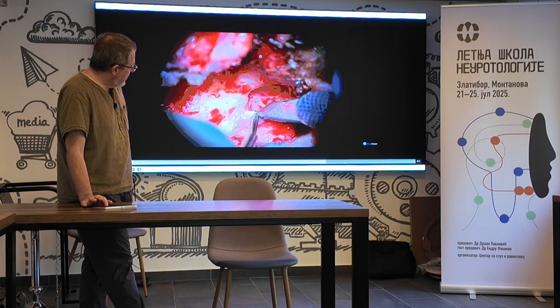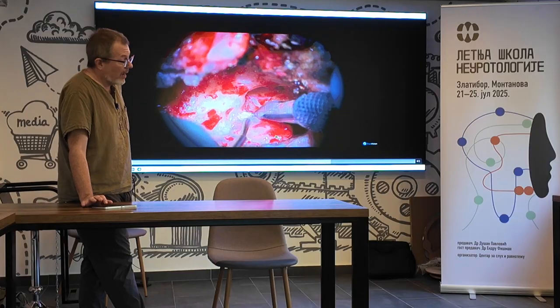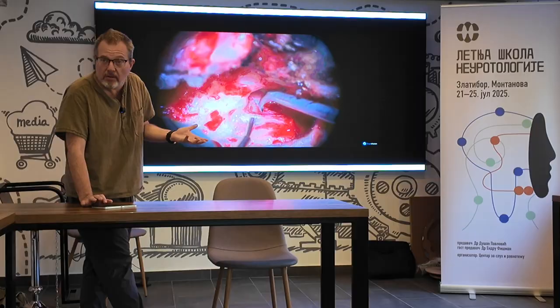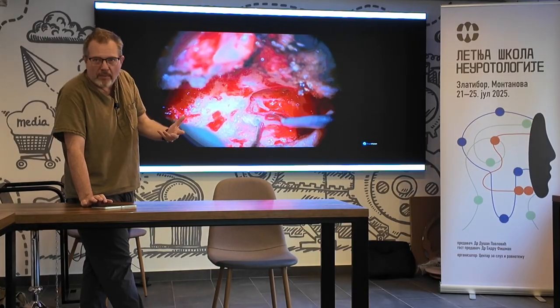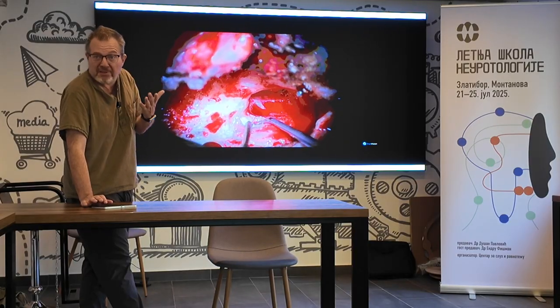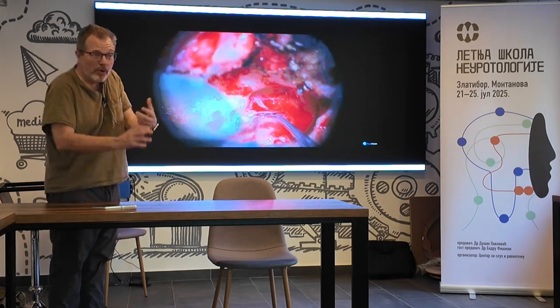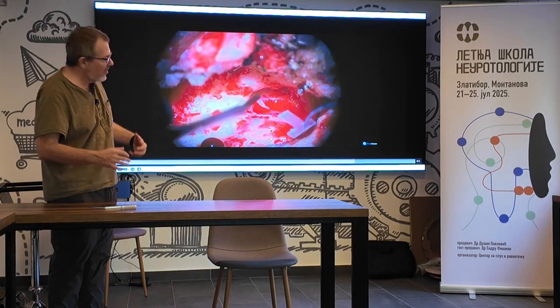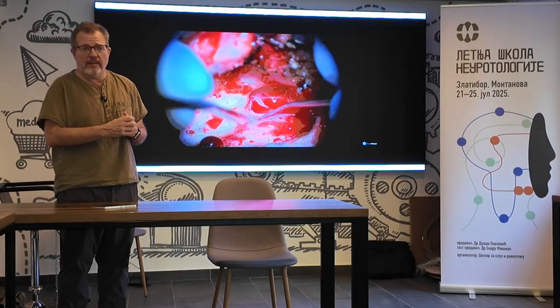And I put the shunt made of silicone, and there is some suspicion that perhaps there is some kind of an immunological response to the silicone. I mean, we know that silicone has some wound healing properties. You know, silicone is used for reducing scar formation in plastic surgery. So maybe there's some kind of immune regulation going on by opening this up.